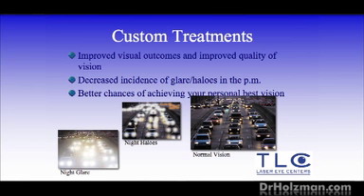And what custom treatment has done is it's improved the quality of eyesight, and it addressed the biggest knock on LASIK for years, which was nighttime vision. Okay, so night vision, where patients were getting glare and halos around lights and things like that. We don't want that to happen to you, and custom treatment seems to be prohibiting that from happening to you.